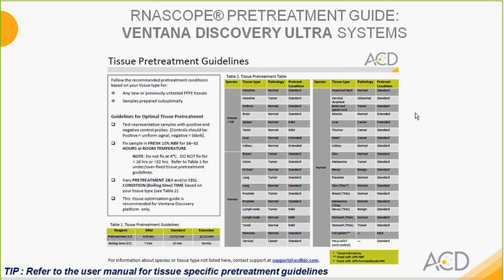Here is an example of a pretreatment guide for VENTANA Discovery Ultra. And as you can see, we have performed different protocols for different samples to give you some guidelines for the VENTANA system, and also giving you some guidelines for how to initiate a pretreatment optimization protocol.